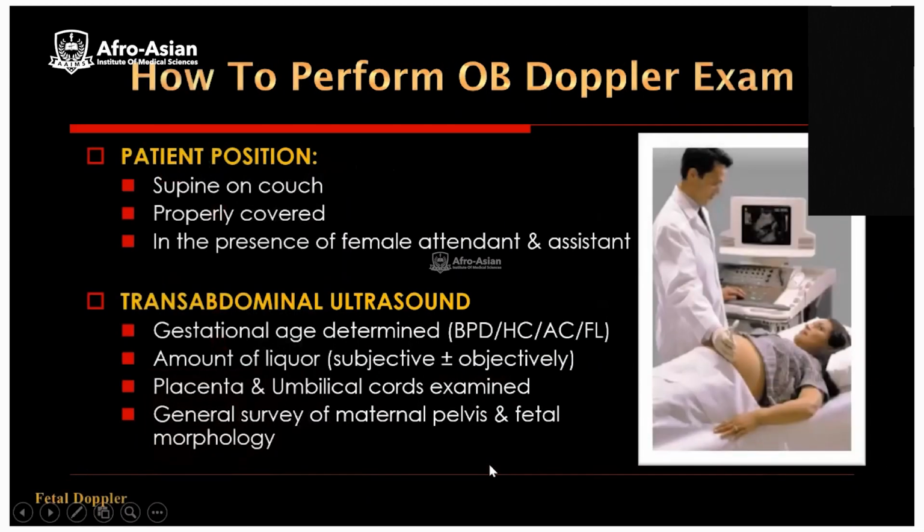How to perform obstetrical Doppler examination? The patient position: patient is supine on the couch, properly covered, in the presence of a female attendant and/or assistant, especially when a male sonographer or radiologist or gynecologist is scanning, transabdominal ultrasound.